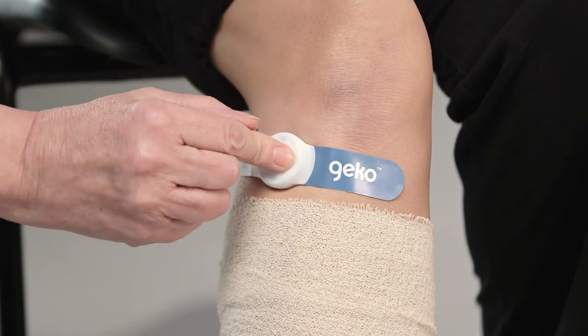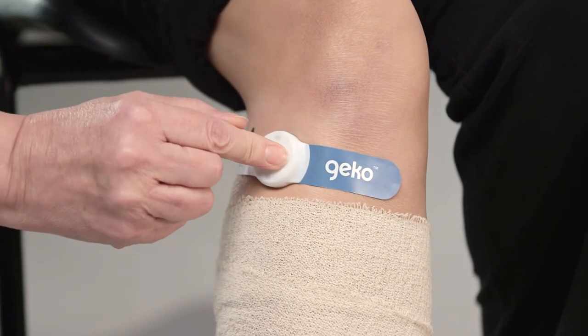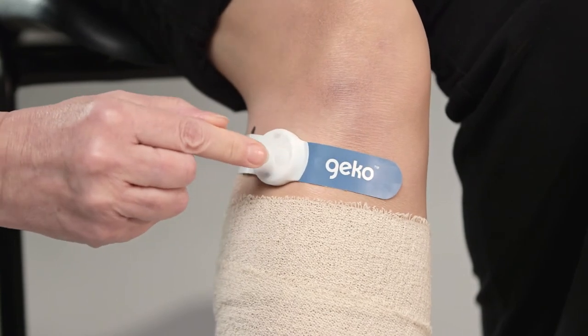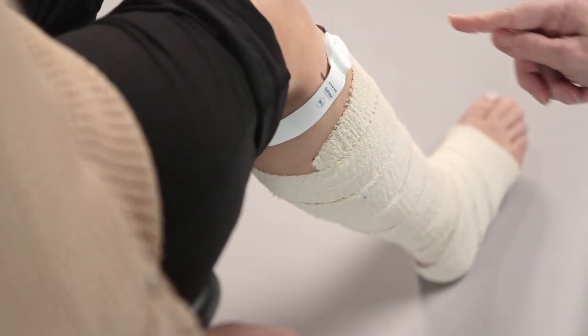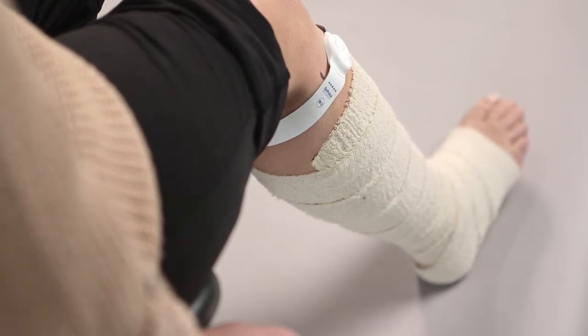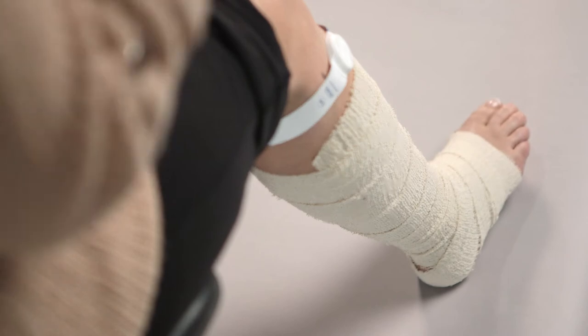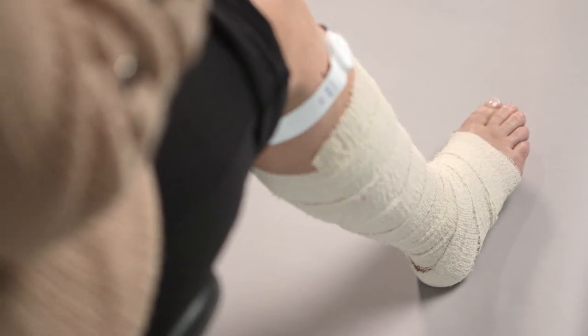The device will start once the button is released. Use further short presses to set the appropriate stimulation level, reached when there is a visible movement of the muscles in the lower leg, moving the foot outwards and upwards. Set the stimulation level to the maximum the patient can tolerate easily. To alleviate any patient anxiety, it is important to ask the patient what they feel at each increase of the stimulation level.